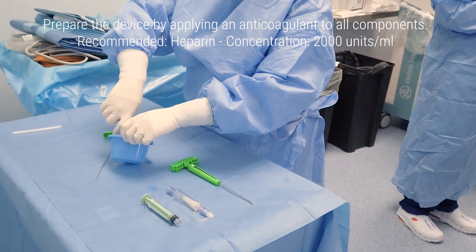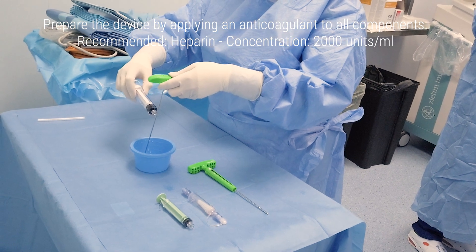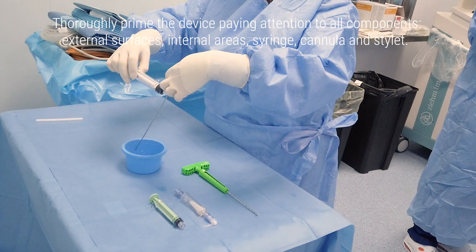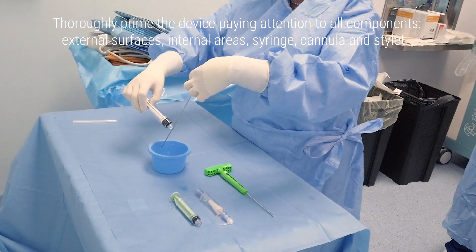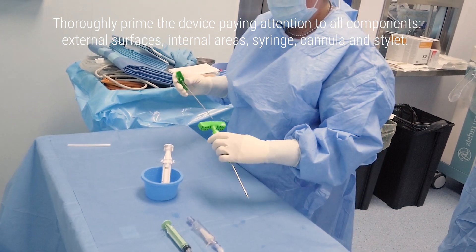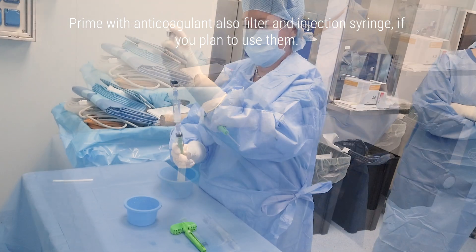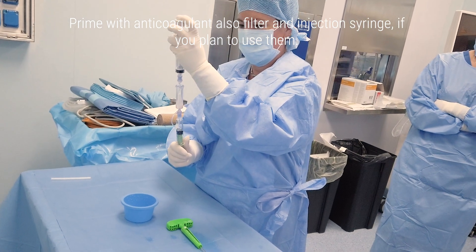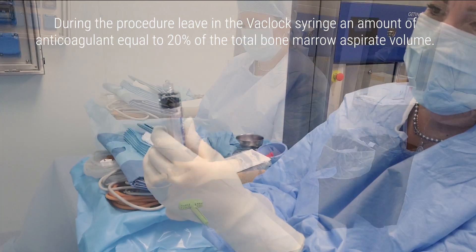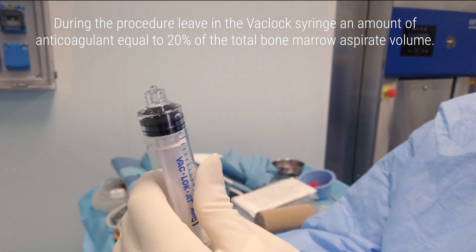Prepare the device by applying an anticoagulant to all components. Recommended heparin at the concentration of 2000 units per milliliter. Thoroughly prime the device, paying attention to all components: external surfaces, internal areas, syringe, cannula, and stylet. Prime with anticoagulant also the filter and injection syringe, if you plan to use them. During the procedure, leave in the vac-lock syringe an amount of anticoagulant equal to 20% of the total bone marrow aspirate volume.